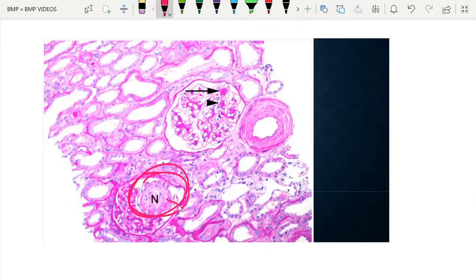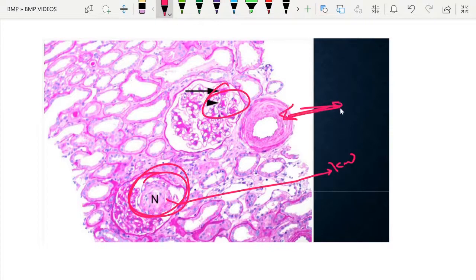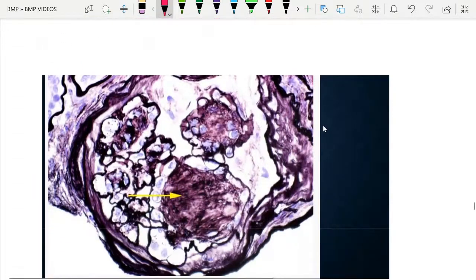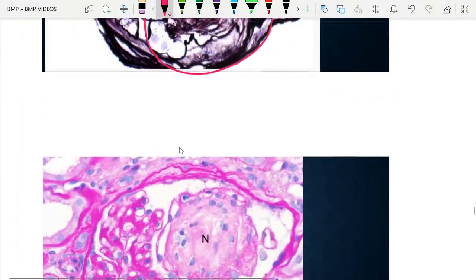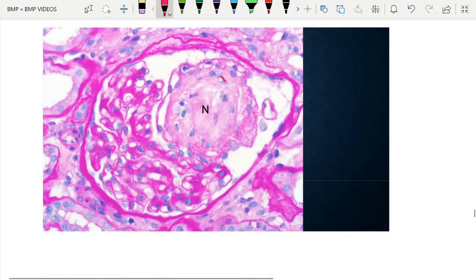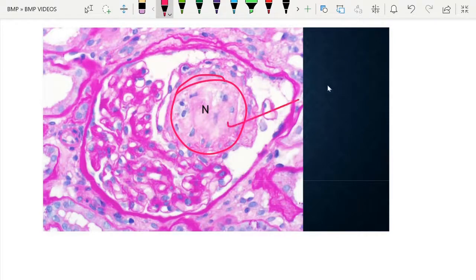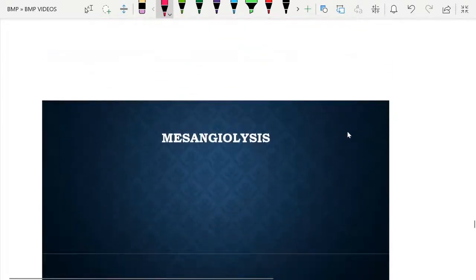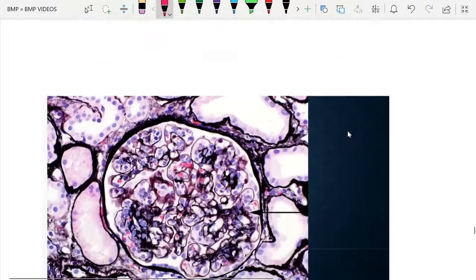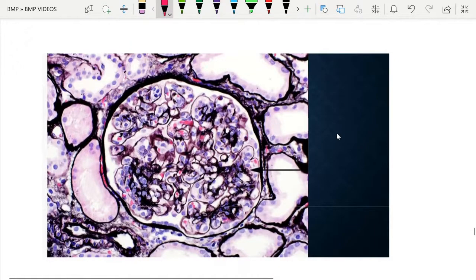Multiple images in PAS and methenamine silver stains show the KW nodules varying from very small to large sizes — sometimes almost half of the glomerulus being occupied by nodules. Mesangiolysis is the disintegration of the mesangium; during mesangial matrix expansion, mesangiolysis can occur, and the cells are lost, which may result in formation of microaneurysms.